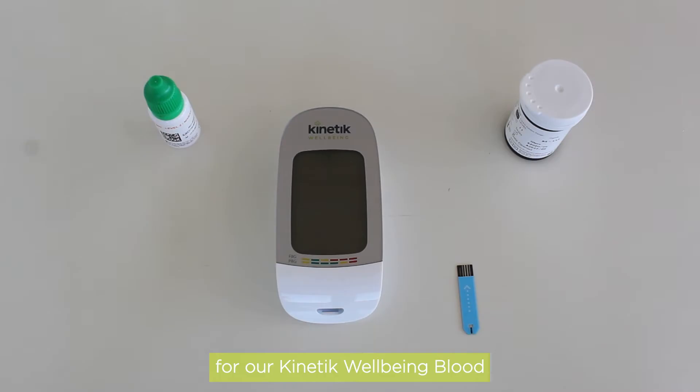Welcome to the demo video for our Kinetic Wellbeing Blood Glucose Monitoring System. Here we will be covering how to perform a quality control test. Our glucose control solution contains a known amount of glucose that reacts with the test strips and is used to ensure the meter and the strips are working together correctly.